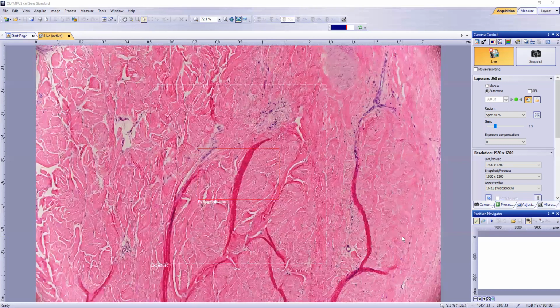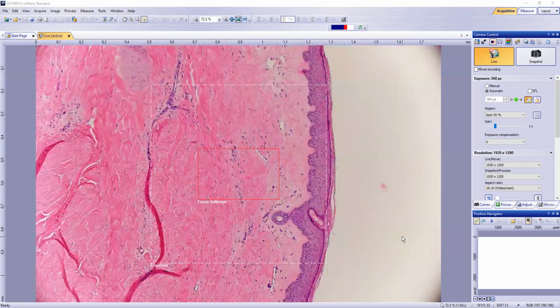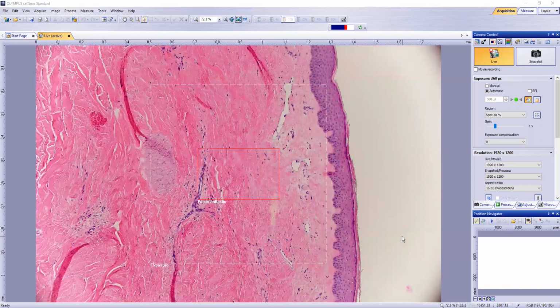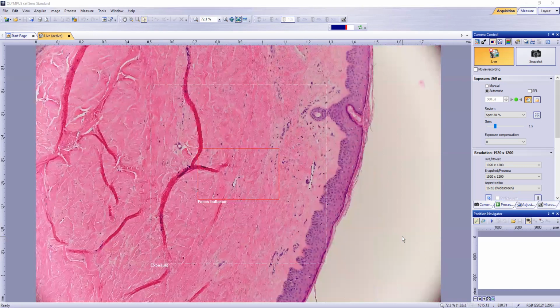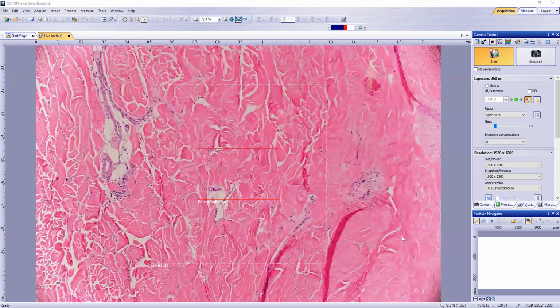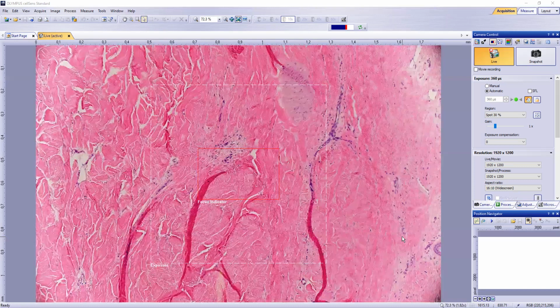And those are really the key distinguishing features of scleroderma. So you don't have vacuolar alteration, the epidermis looks normal, you don't have follicular plugging, you don't have orthokeratosis. The papillary dermis is not as affected as the reticular dermis, although you do definitely have some sclerosis of the papillary dermis. And again, it tends to be pandermal sclerosis of both the superficial and deep dermis. And then, as I mentioned, the adnexal structures are absent.